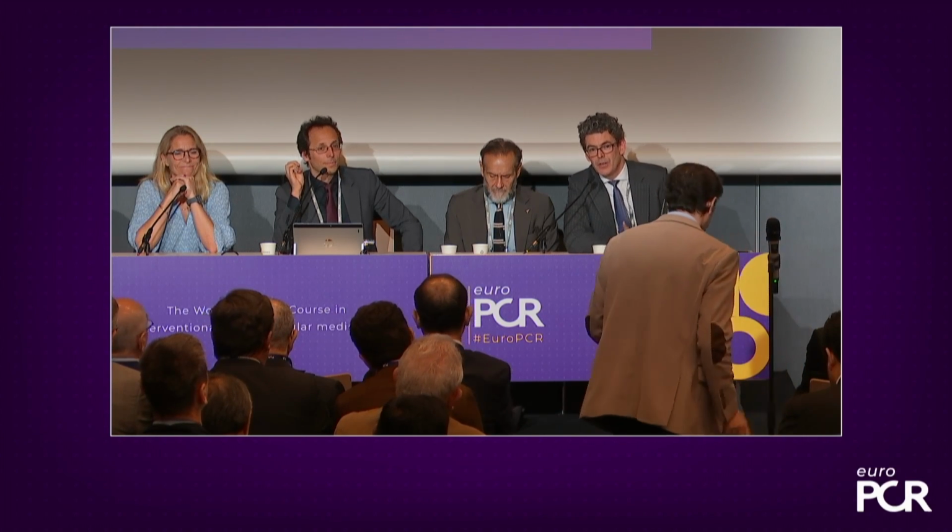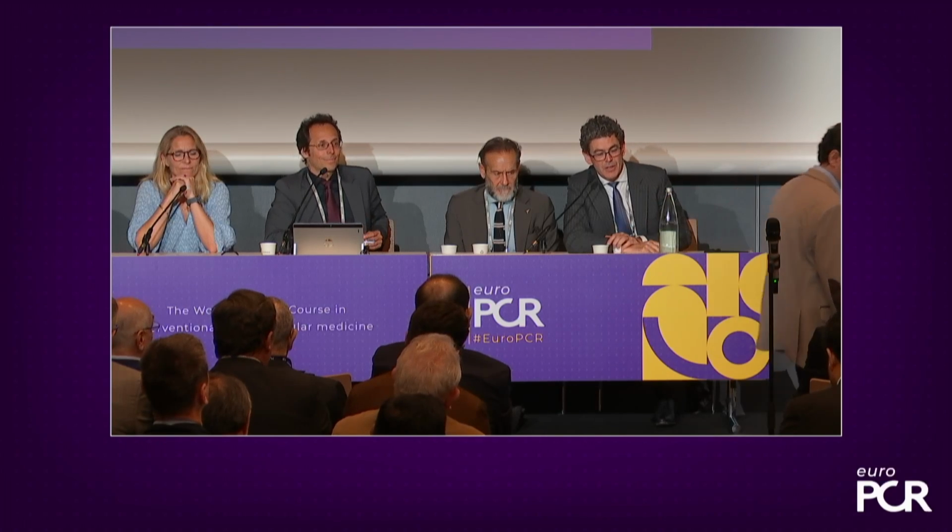I think the recoil in this situation is most likely due to a very highly fibrotic lesion where there is a retention of the elasticity that's causing constriction, that you would be able to counteract with a higher radial force stent. But the question regarding calcium modification after stenting, yes, it's possible, but I would say it's better to do it before than after.